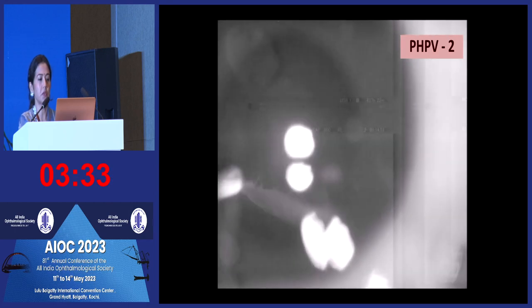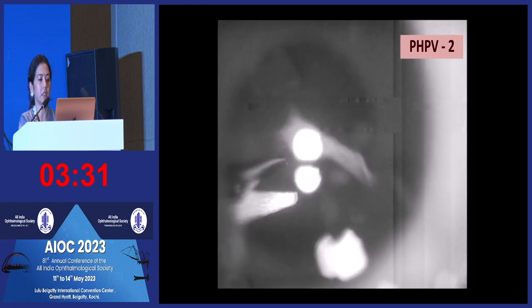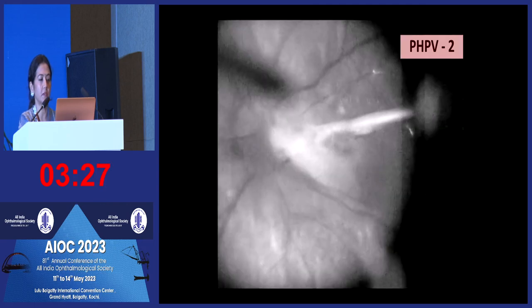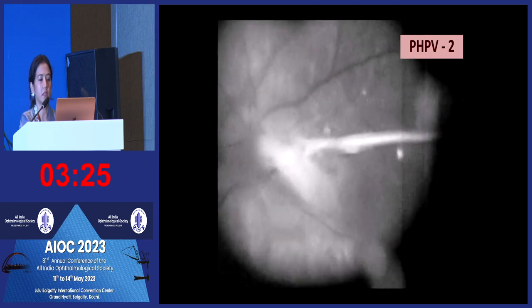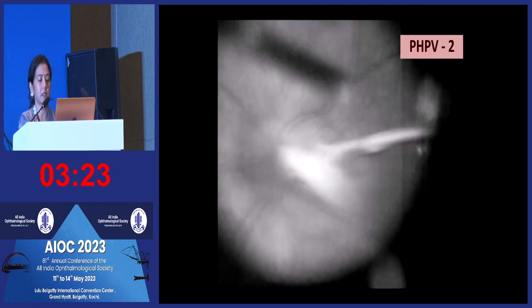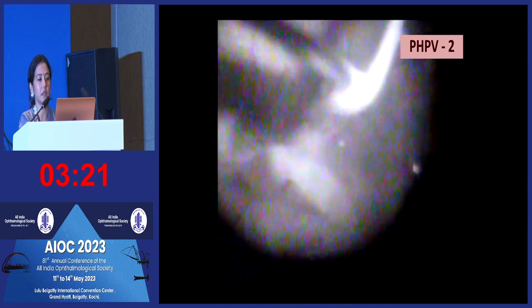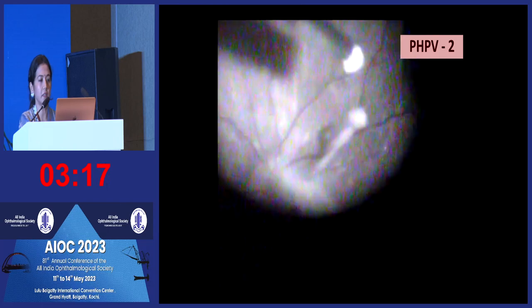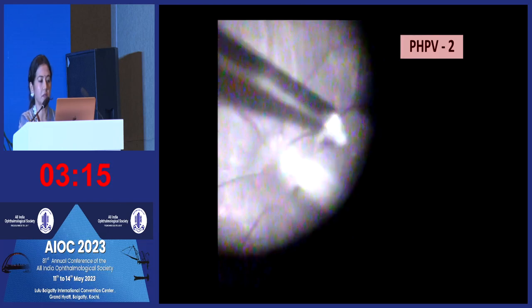So this is not a posterior polar cataract, it's just the attachment of the posterior tag. And once you release, you can see how it falls back. Then a core vitrectomy was done, and this fibrous tissue connected to the disc was dissected using a cutter.